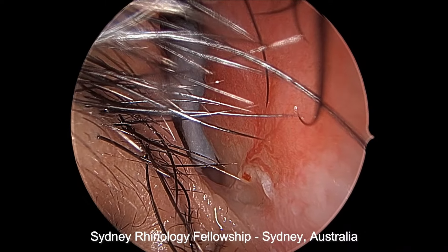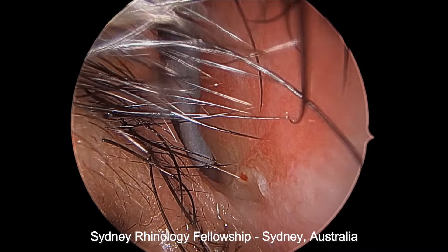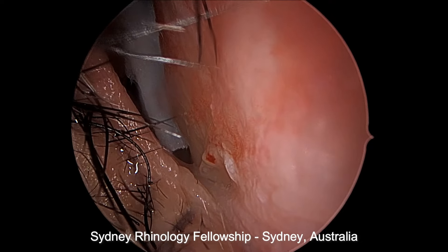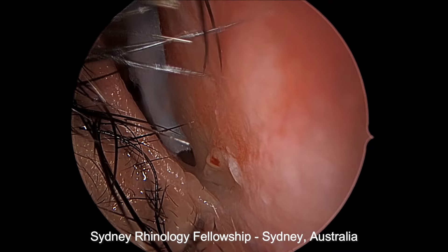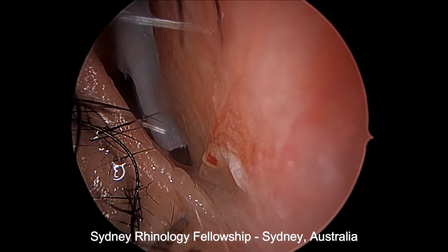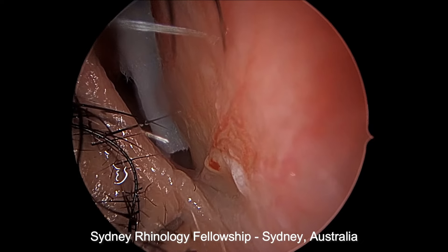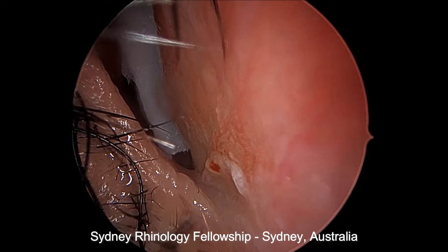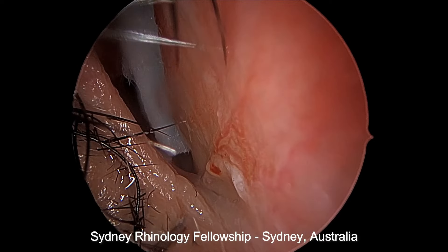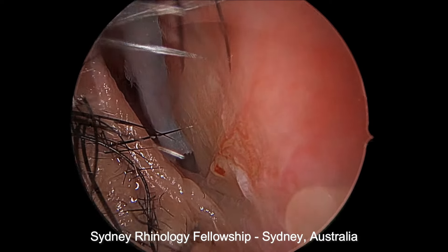Local anaesthetic is being injected into the base of this area, being close to the skin of the nasal vestibule. It's very sensitive, and it's important to get good analgesia. In the injection, you can even see the flow of the blood within the vessels itself.